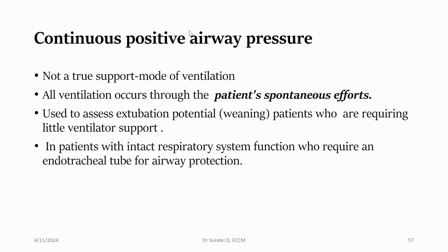Especially for those working in pediatrics, you can have a locally made CPAP. Those also have similar effects. It is usually used to assess extubation potential for patients who have spontaneous breathing. Especially for those of you who are using a ventilator, you can use CPAP to assess whether the patient is extubable or not. So you can assess daily whether he's tolerating CPAP or not. And you can also use a T-piece.